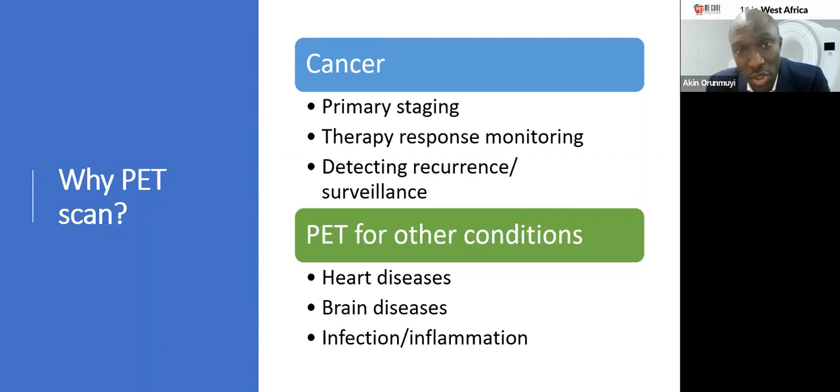But it's not just useful for oncology alone, it's also useful for cardiology, for brain imaging, and more recently has been applied for infectious or inflammatory diseases. Next slide, please.